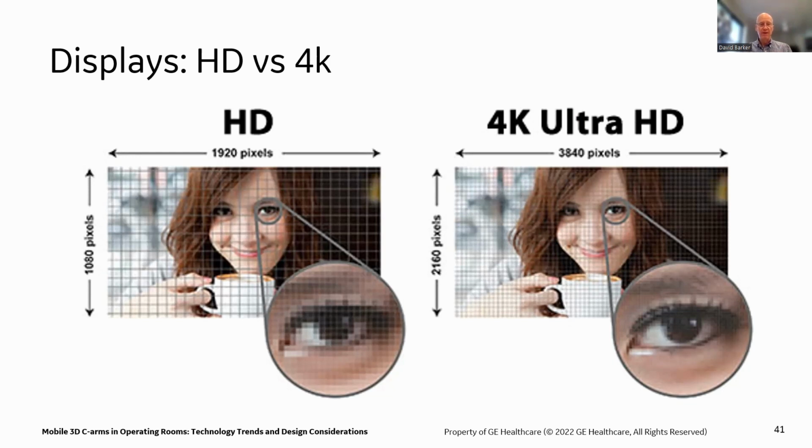So with the technologies that are out there, you're doing yourself a disservice if you're not going with the 4K display with all the calculations and all the resolutions that everybody has on the detector. You really want a 4K or better to give you full resolution on the output side of the problem rather than just worrying about the input side.